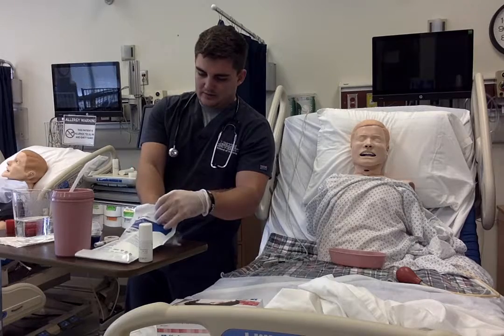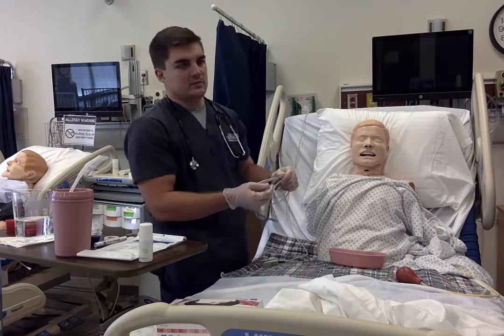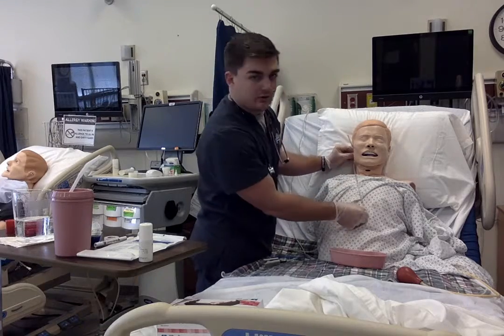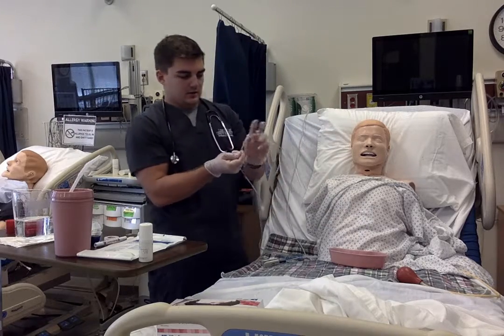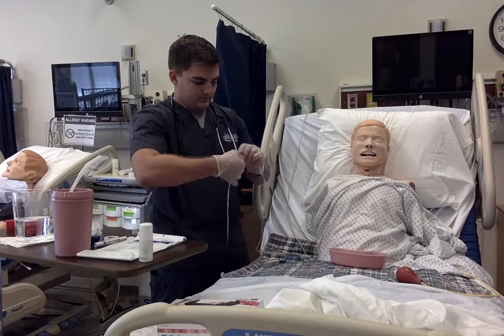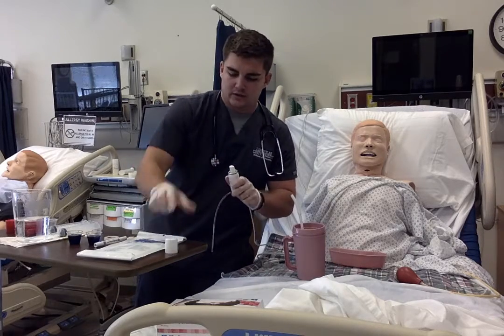Then I would get the NG tube ready and measure the tube placement. I measure from the tip of the nose to the back of the lower earlobe, and then from the lower earlobe to the xiphoid process. Then I would note the distance where that measurement falls. I get my water ready and lube approximately 4 inches of the NG tube.